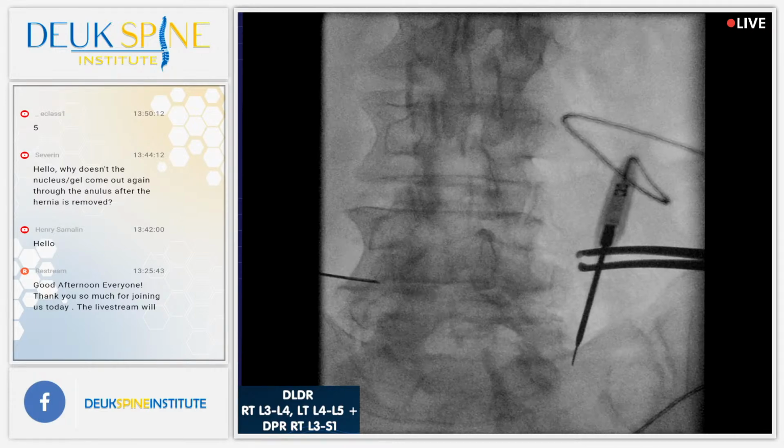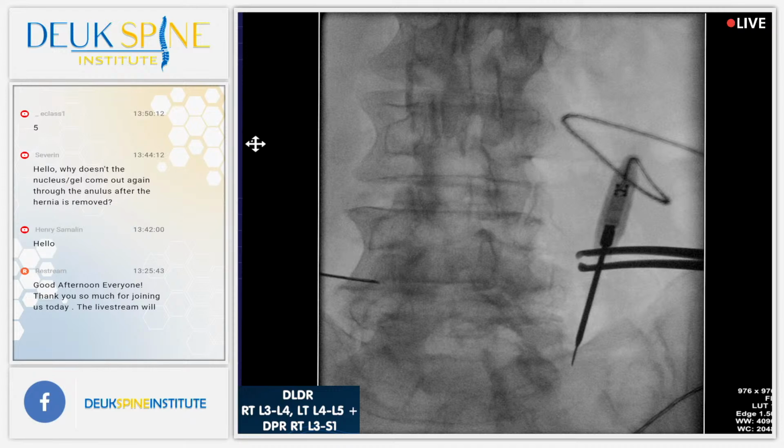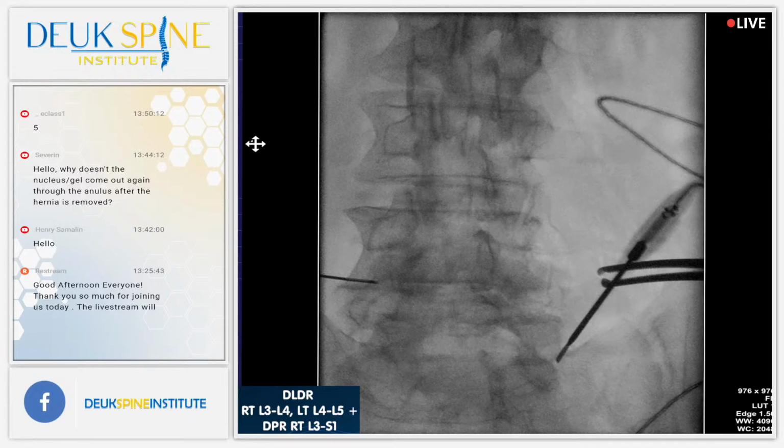That's not bad. I can feel the bone there. X-ray, 30 seconds. Let's have a little depomedrol. Oh yeah. Thank you, Luis. Because that's all we're going to be able to do there. All right, I feel like I got the nerve good, and we're done.